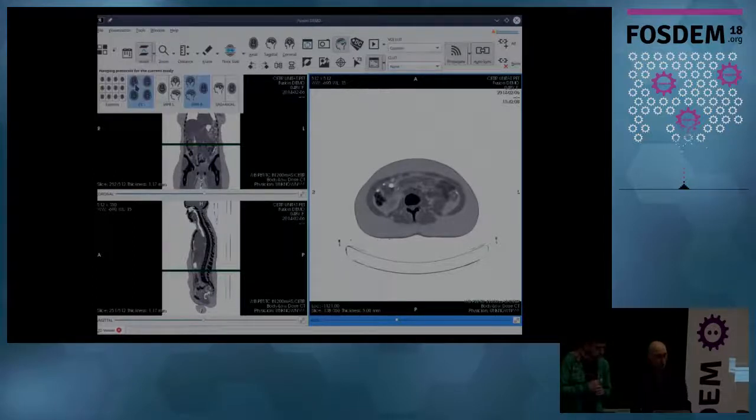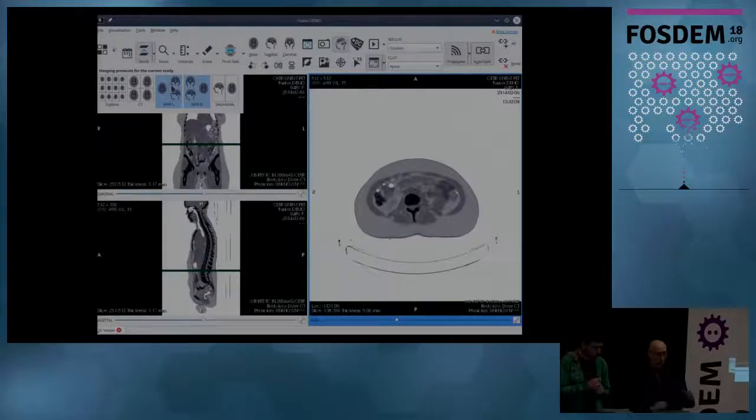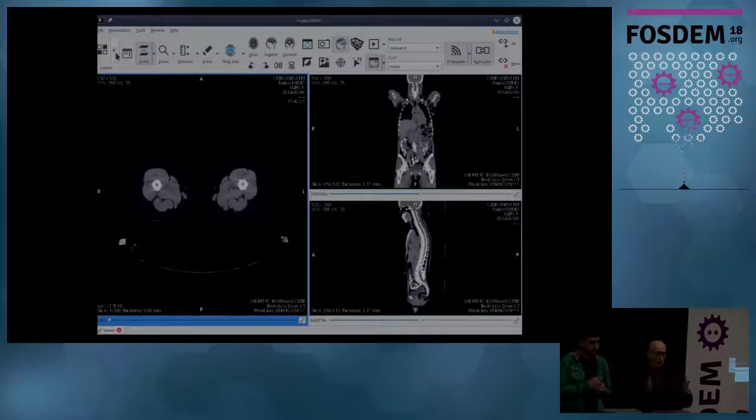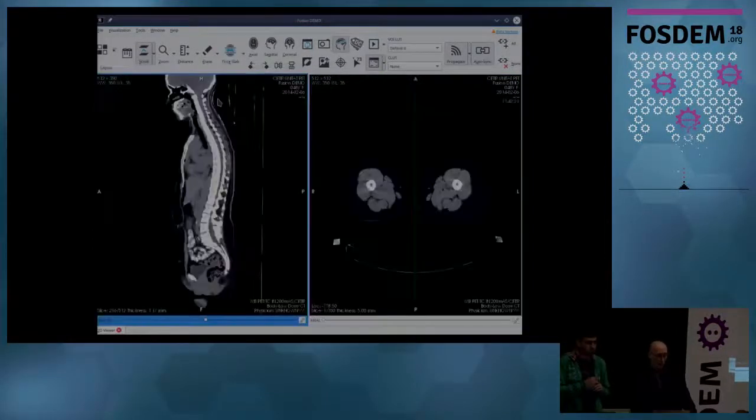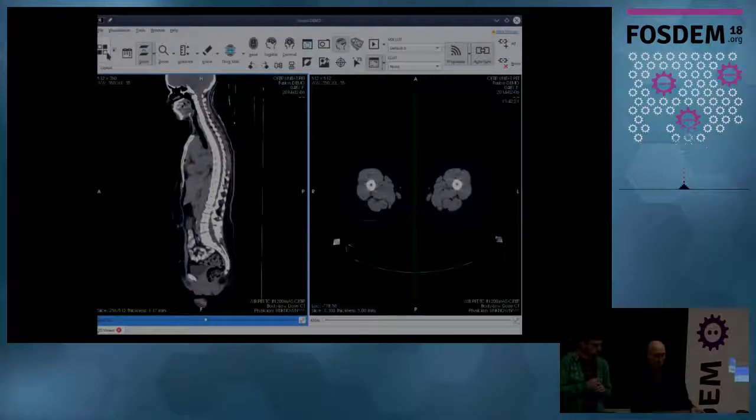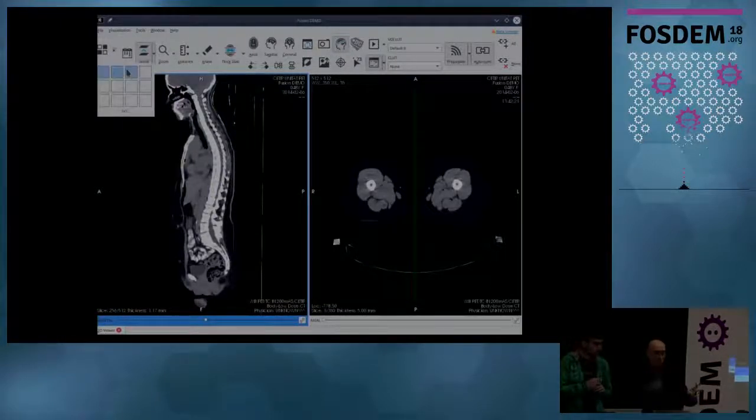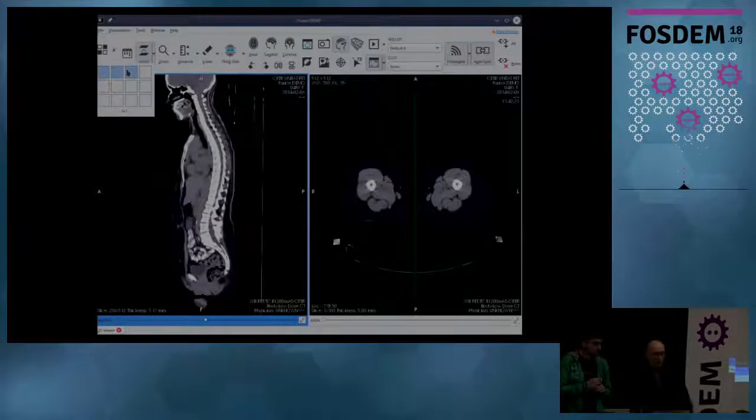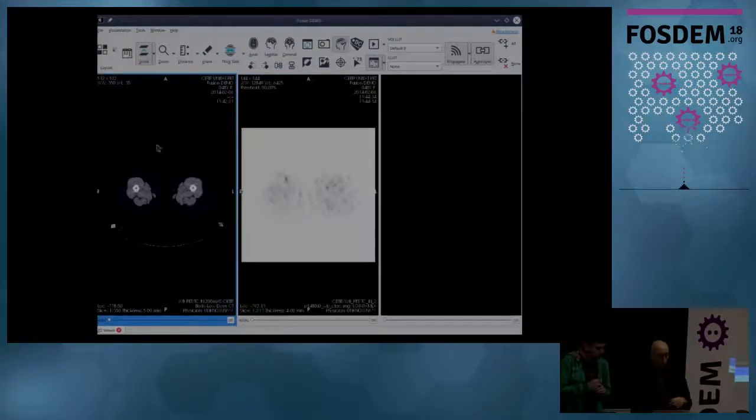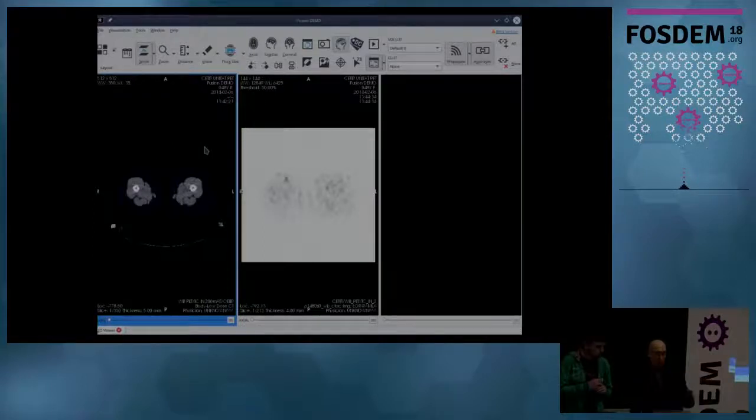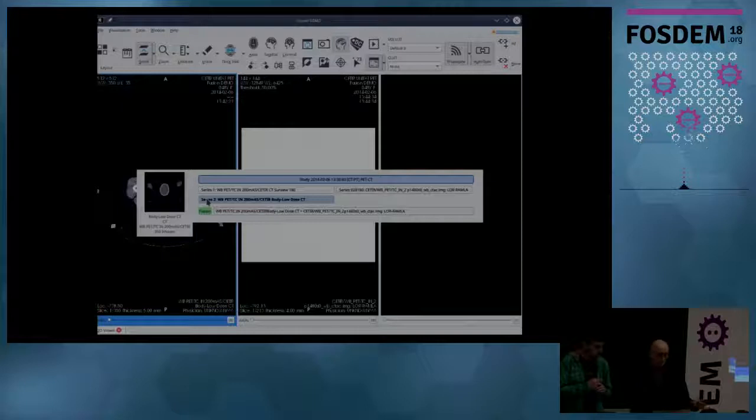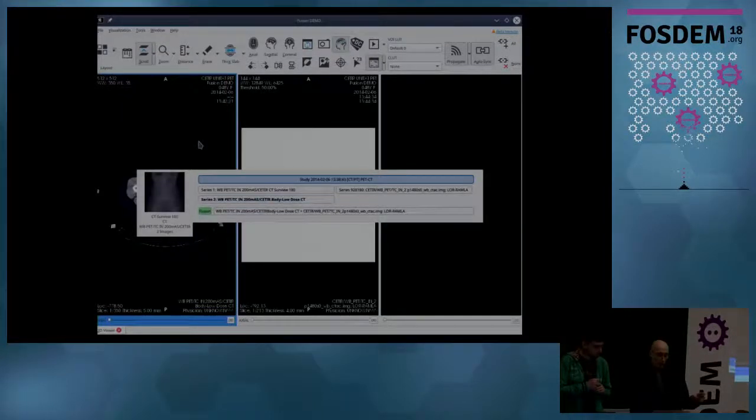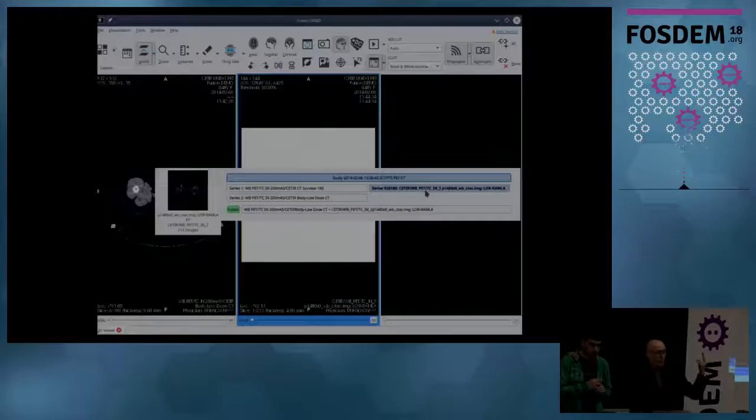Then there is what we explained before, which is the hanging protocols. Hanging protocols are templates that can be customized with XML files that, if you are a doctor, you want to set up your diagnosis environment quickly. But in this case, I will put a manual layout of three viewers. And in these three viewers, now I have, if I right click, I have the series 2, which is the CT scan.